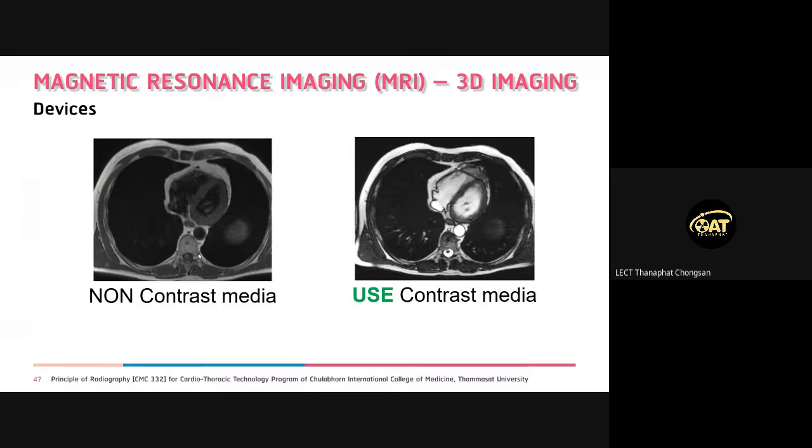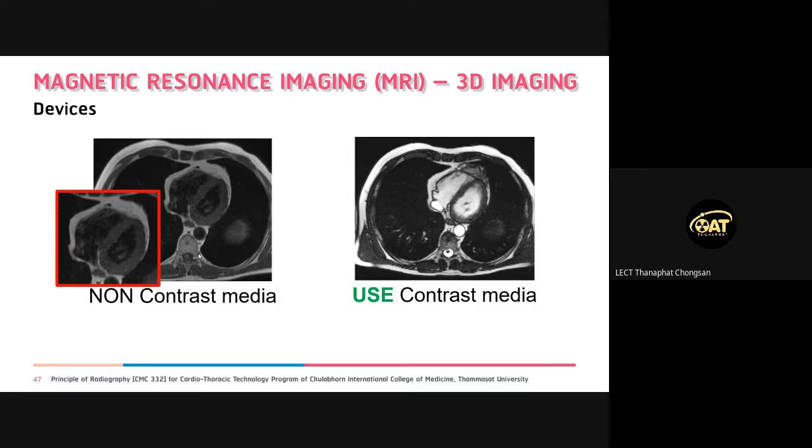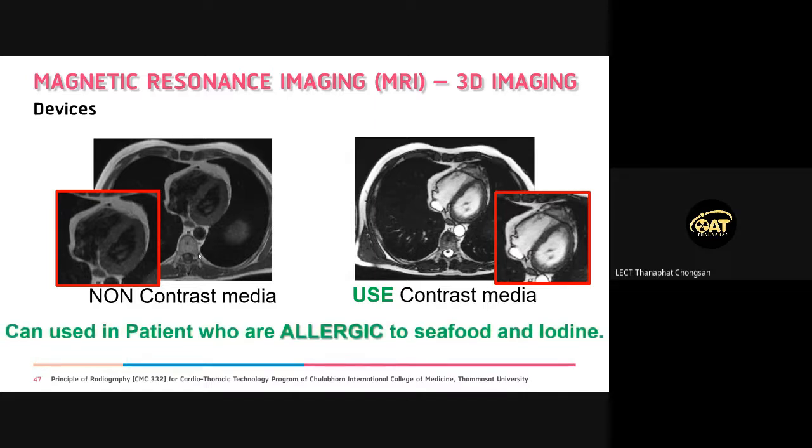Okay, here are images comparing without and with gadolinium. This one is without gadolinium. This one uses gadolinium, the contrast media for MRI. The contrast media of MRI can be used with people who are allergic to seafood or iodine.